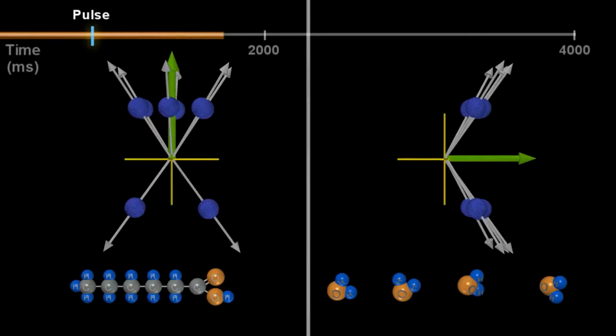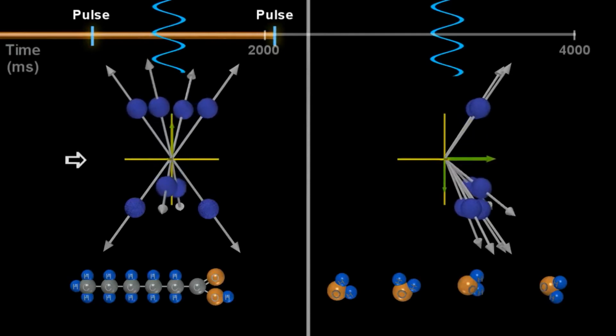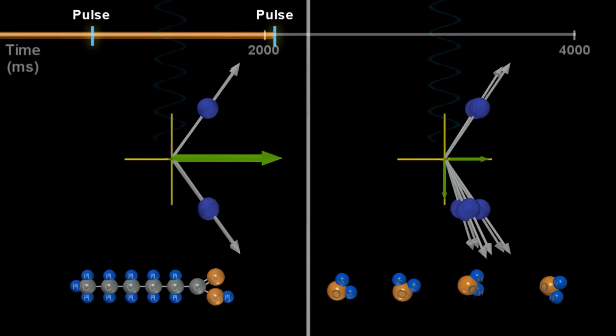Again, because the protons in water are fluid and move freely, they tend to hold on to that energy longer, and the protons stay in the higher energy state with little regrowth of the longitudinal magnetization, whereas the tightly packed fat protons more rapidly give up that energy and return to the low energy state, thus rapidly regrowing the longitudinal magnetization. If we then quickly put in another resonant 90-degree radio frequency pulse, the fully recovered fat protons will produce a large transverse magnetization and a strong measured signal that we can record if we listen to the return signal or echo shortly after the second radio frequency pulse.